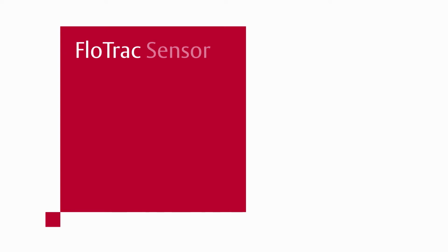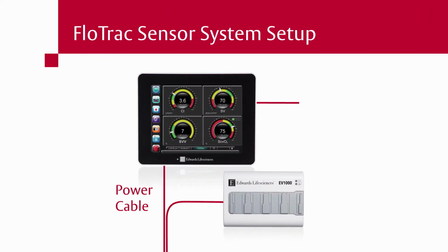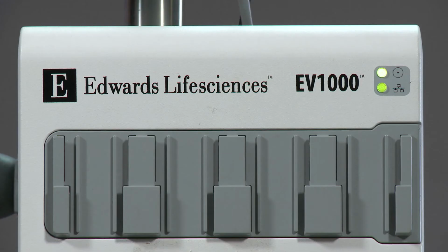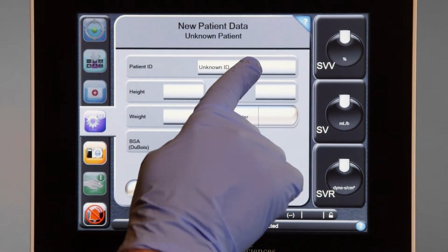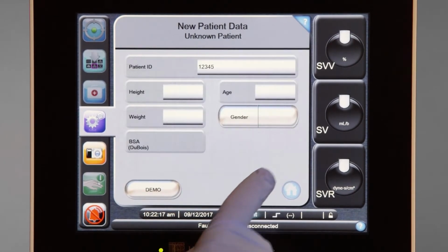Begin setup of the EV1000 clinical platform by confirming that components are present, properly connected, and in good condition. Make sure the power cable is connected to both the monitor and data box, and that an Ethernet cable is present between the monitor and the data box. Turn on the EV1000 clinical platform by pressing the power button on the rear of the monitor. Confirm that the data box LED lights are both on and green. After the startup screen, enter the patient's ID number as well as their biometric data: height, weight, age, and gender.